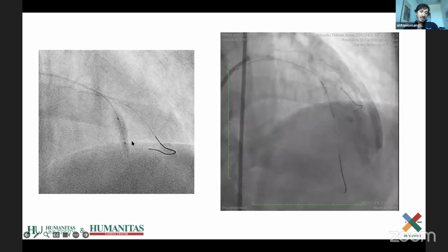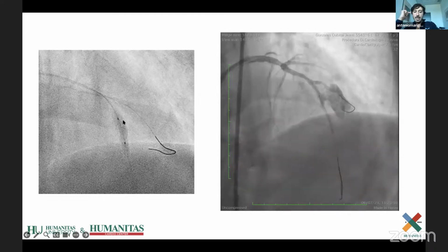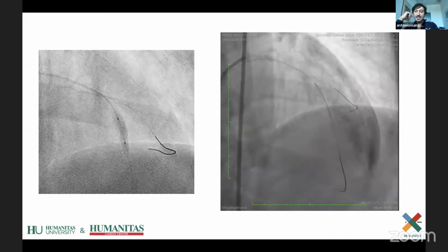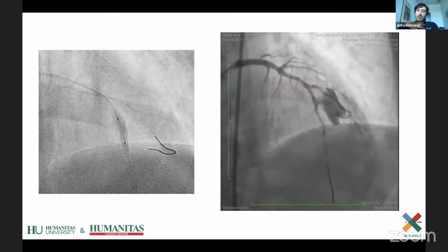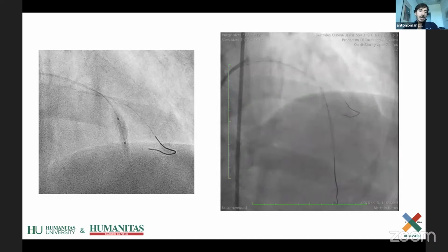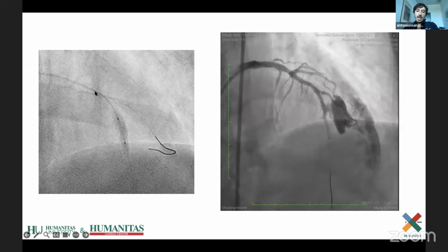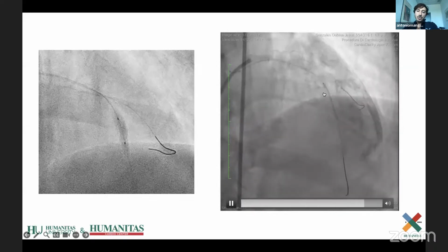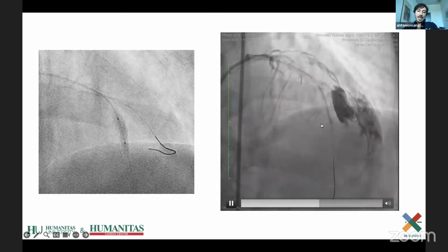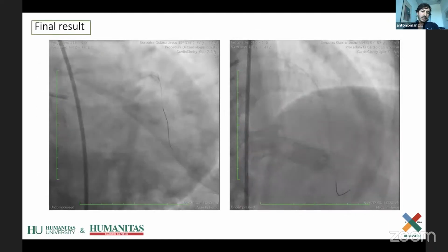Because this is a tapered balloon in this area and is bulging outside the vessel in this other part. So when I deflated the balloon, the patient had chest pain immediately. I inflated the cutting balloon again in the proximal part. I sealed and I utilized the ping pong technique. The image that you see here is the covered stent. And finally, the result was that one.